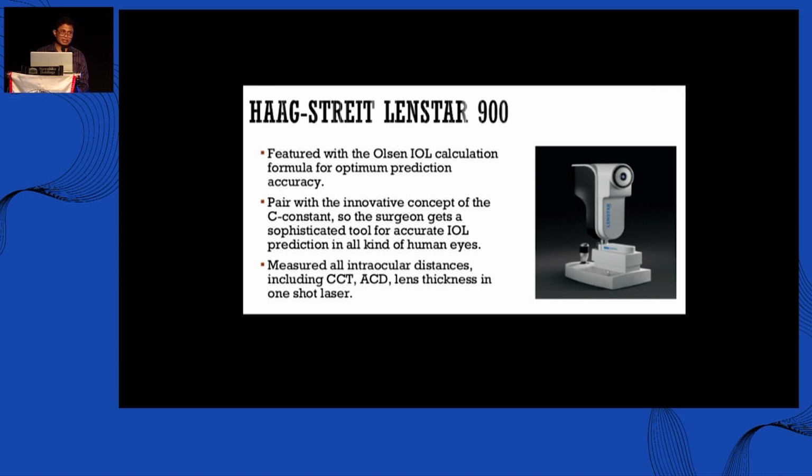The thin lens formula is an assumption that we make to calculate, and in usual settings it will be okay. But in other scenarios, like extreme hypermetropia and extreme myopia, it will not be accurate. So then it's better to have exact ray tracing. You trace the rays, how they behave inside the eye and the lens, so theory-wise, Lenstar is much more accurate, right? And it uses a factor called the C factor in the Olsen formula.